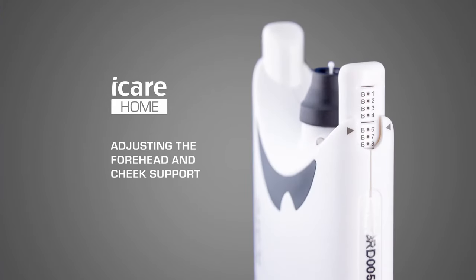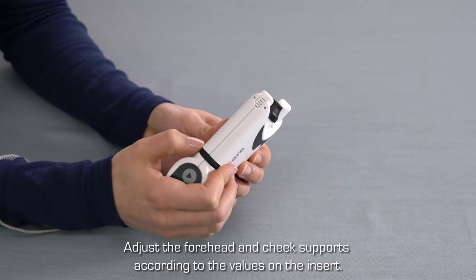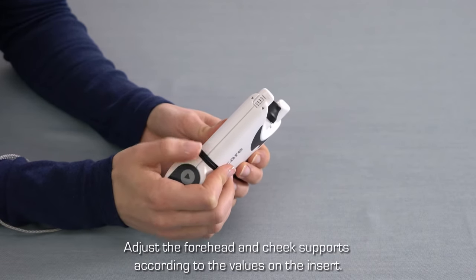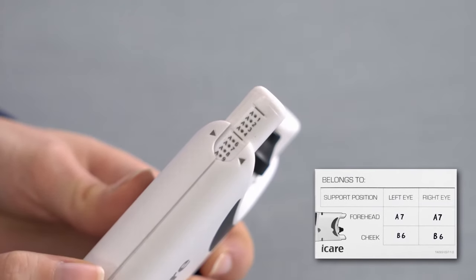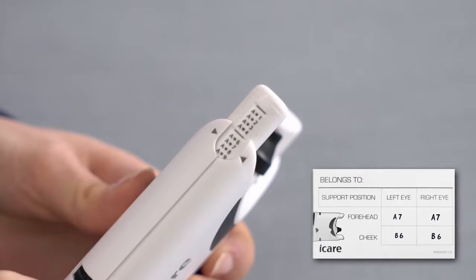Adjusting the forehead and cheek supports. Adjust the device's forehead and cheek supports according to the values given in your user training. You can check your personal settings from the carrying case insert provided in the training.